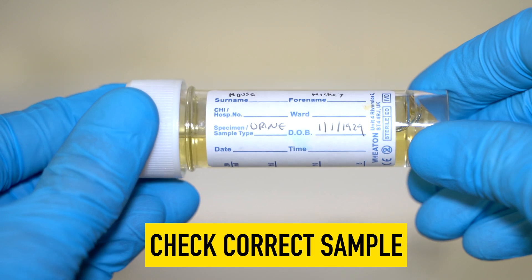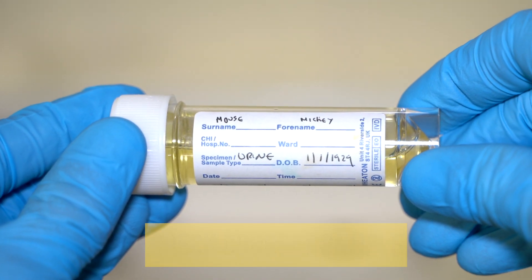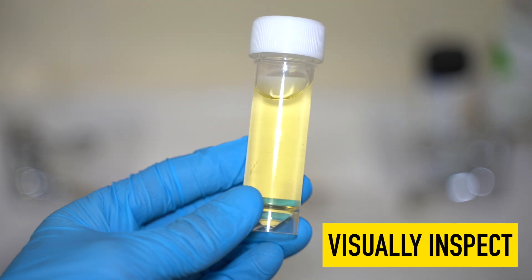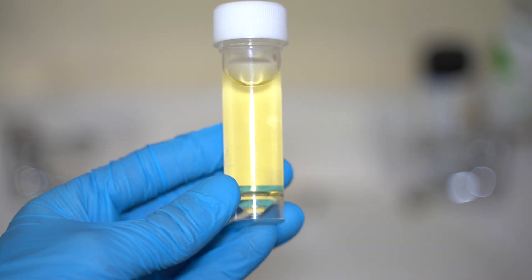Having donned your appropriate PPE, you then need to get your sample. We want to make sure that we can confirm the patient's name and date of birth matches the sample that we think we're going to be analysing. Then we need to actually visually assess the sample — does there appear to be debris in it? Is it cloudy? Is it murky?